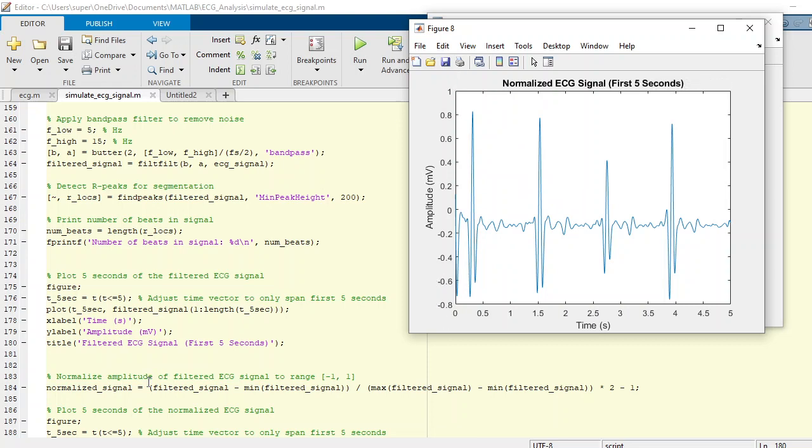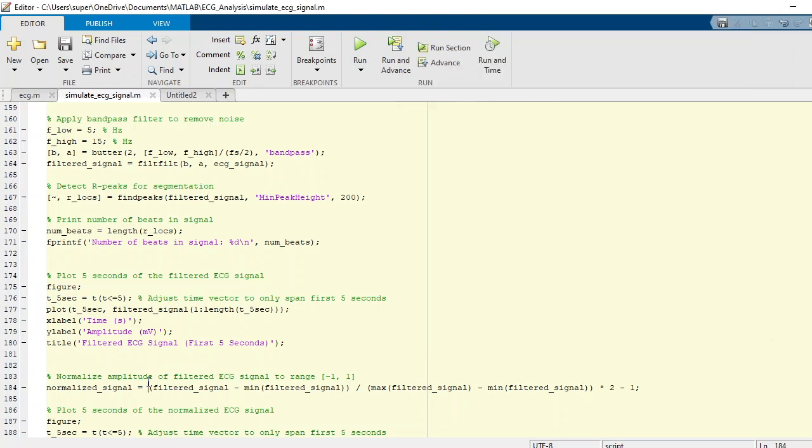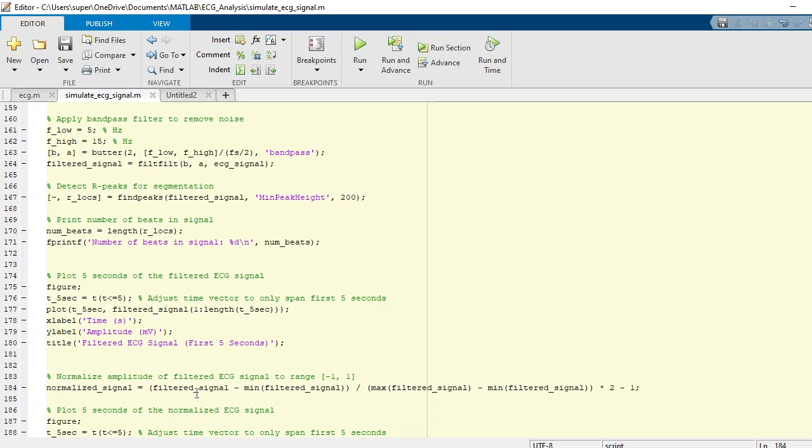How can we achieve this normalization? Here is a function to normalize the data. The normalization of the amplitude of the filtered ECG signals ranging from minus one to one. We can simply input the filtered signal minus the minimum value in that filtered signal, divided by the maximum value from the filtered signals minus minimum value of the filtered signals, multiplied by 2 and minus 1.